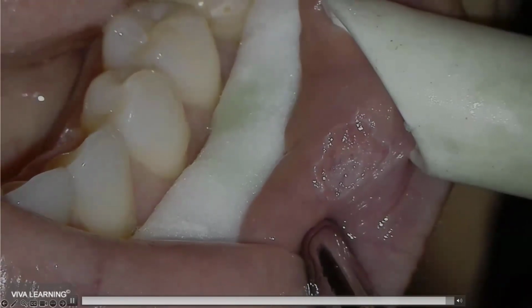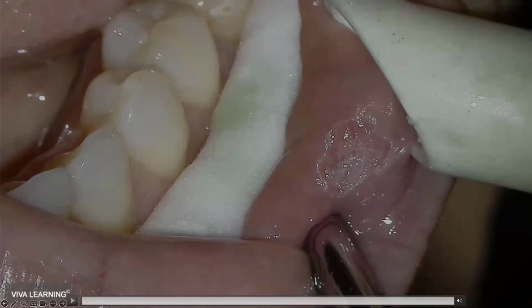So here's a question that came in from an existing user: I've used Soleil a few times in soft tissue, but have had bleeding. Is this a spot size or a power issue? One of the things that you saw there is if the blood vessel is big enough, so this fibroma had been there long enough that it actually had some accessory blood vessels growing in there, and the vessel was wide enough that the initial lower power of the laser wasn't enough to cause coagulation. So I went back and painted over there, and that was enough.